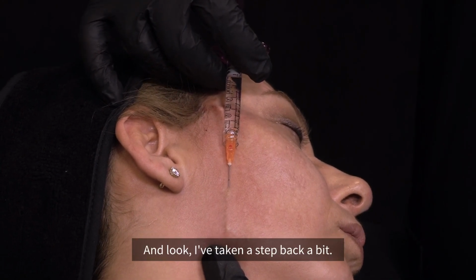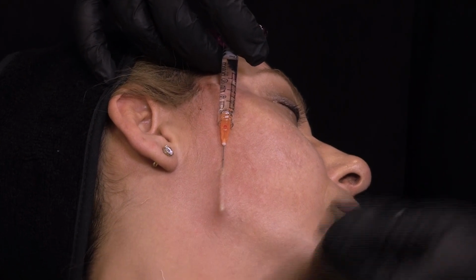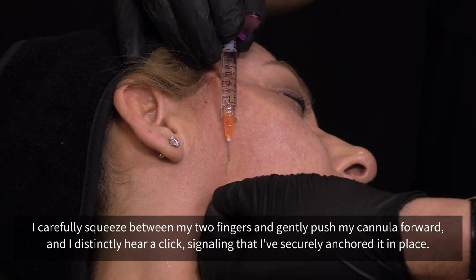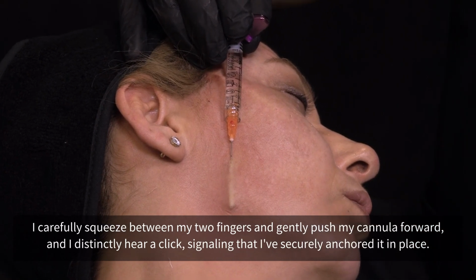And look, I've taken a step back a bit. I want to make the new mandibular angle at this white area. I've reached the desired spot. I've put my finger beneath it. I carefully squeeze between my two fingers and gently push my cannula forward, and I distinctly hear a click, signaling that I've securely anchored it in place.